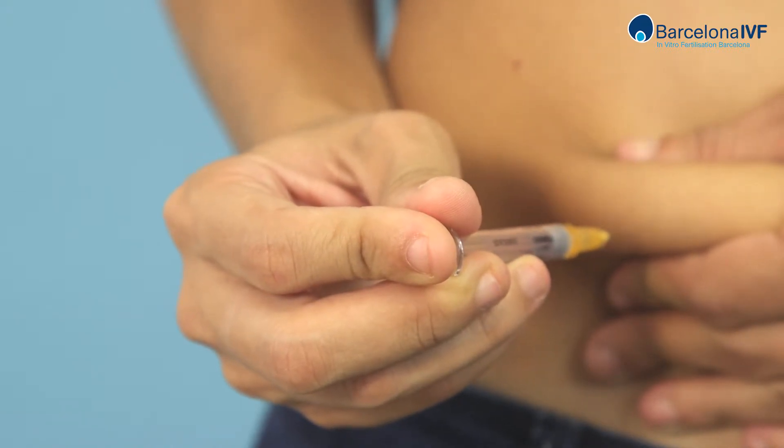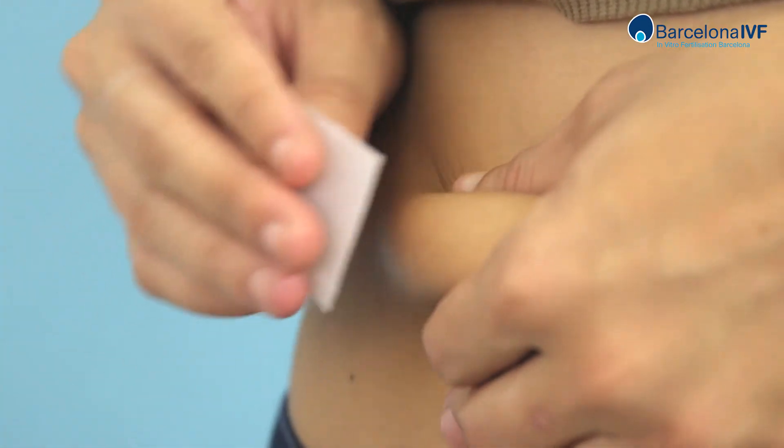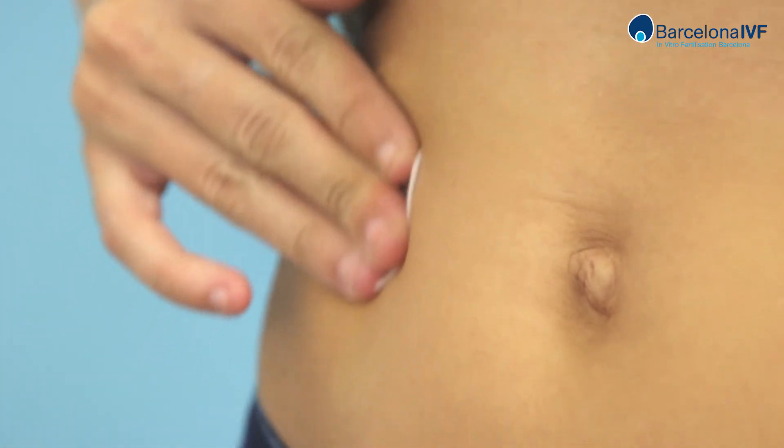Squeeze the plunger until the end. Then remove the needle gently and apply pressure for a few seconds over the treated area.